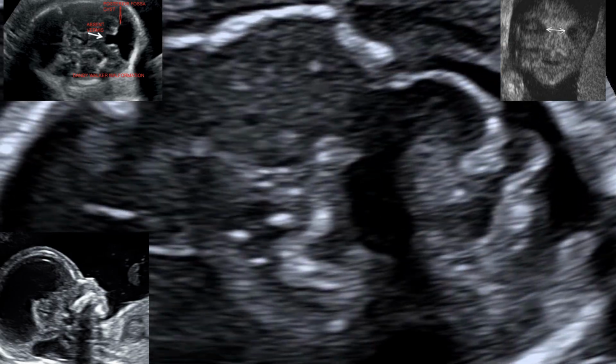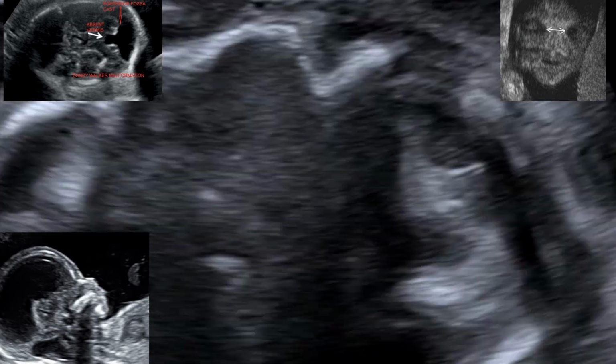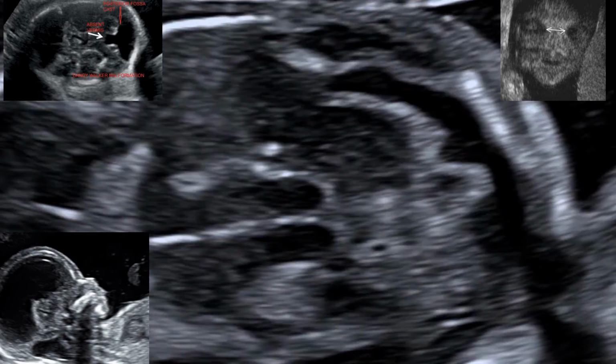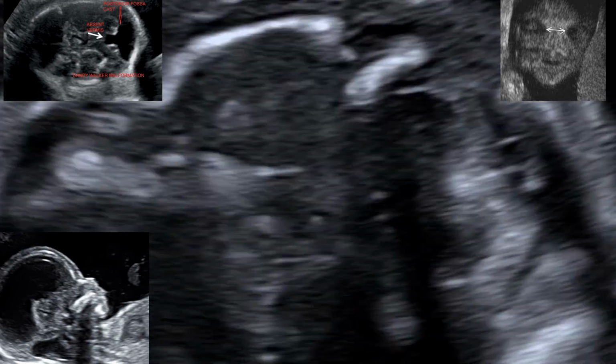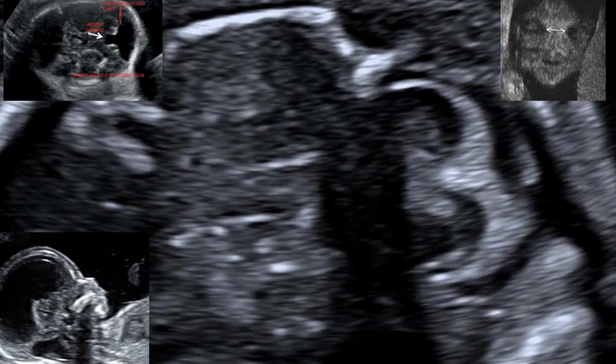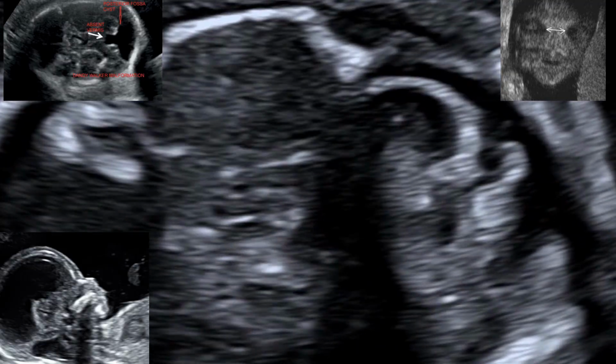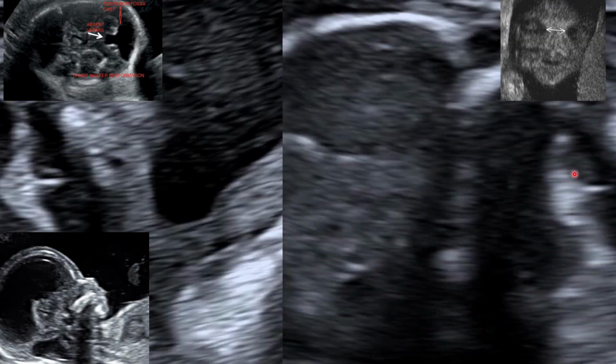If you don't know how to screen for Walker malformation, this video is for you. If you also don't know how to screen for hypertelorism or hypotelorism, this is also for you. So here is how we do it in the second trimester.